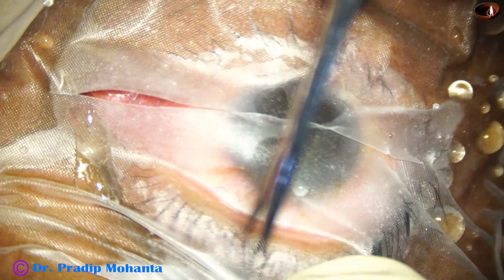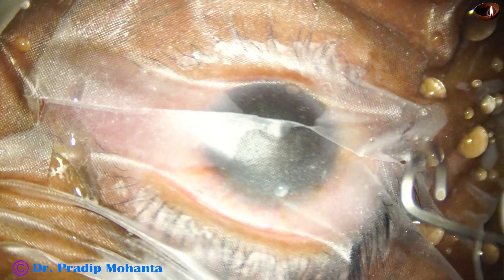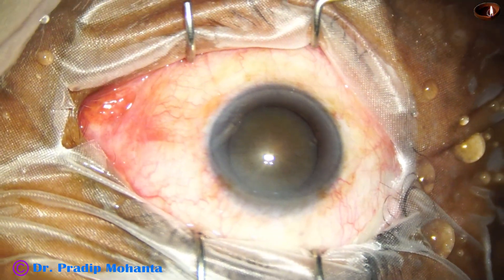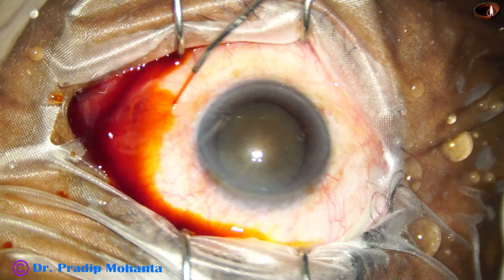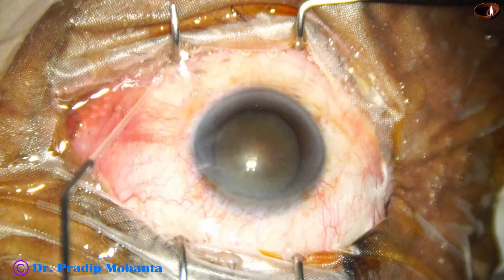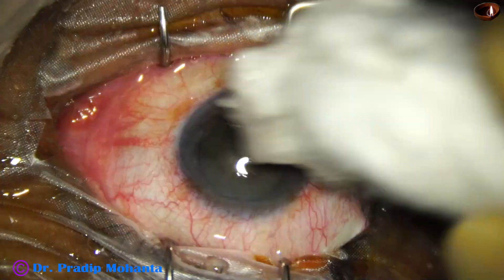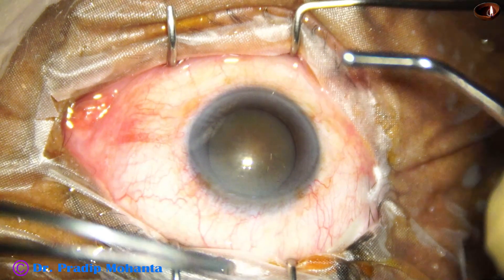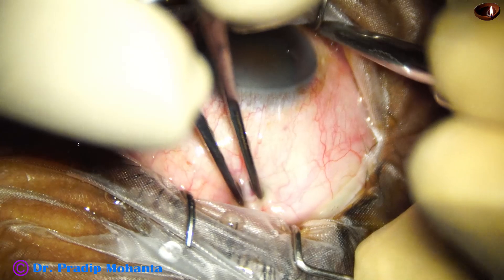The draping should be such that the eyelashes are covered nicely. Then apply a speculum, and now the ocular surface is thoroughly cleaned by applying some drops of povidone iodine. This is a very important step. The ocular surface has been prepared in the preparation room; a few drops of povidone iodine have been applied and kept for 5 minutes.